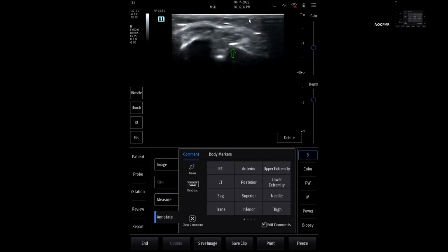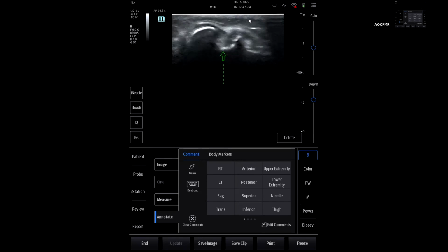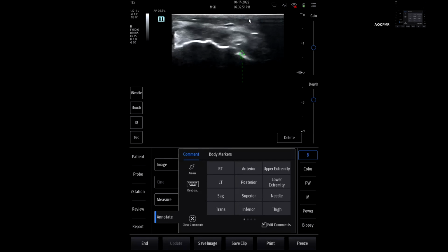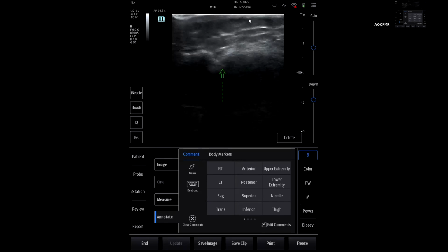Moving inferiorly, this is where it's supposed to insert on the tibia. You see this divot right here? That's not supposed to be there. That's also part of the procedure where they harvested some of the bone. You see that? That's what it's supposed to look like, not this big divot. All right, good. Even though you have first person view.